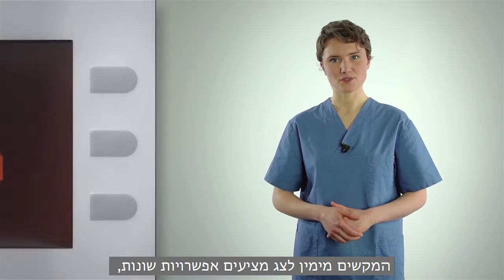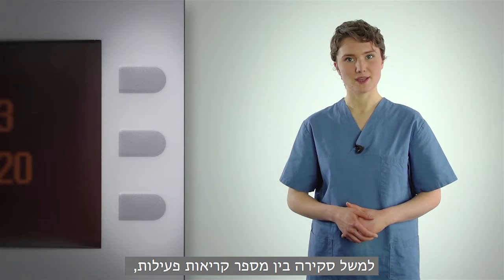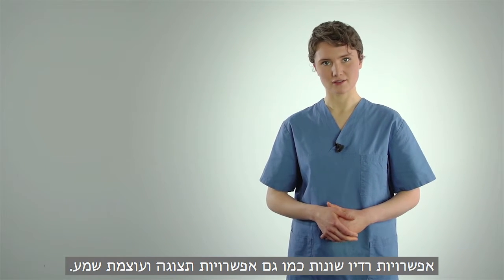The buttons to the right of the display provide various functions, such as scrolling between several active calls, different radio functions, as well as display and volume settings.